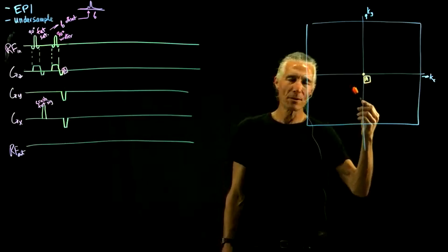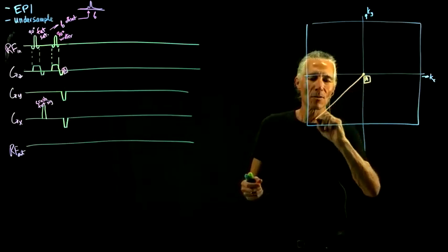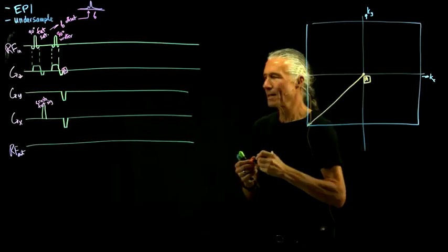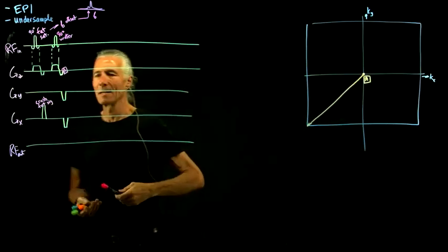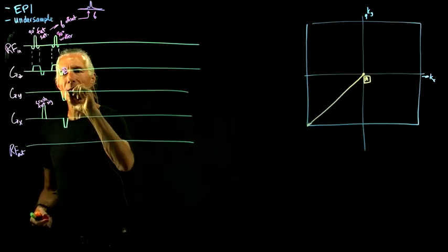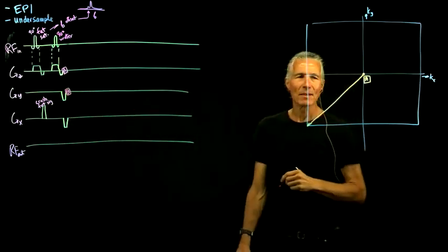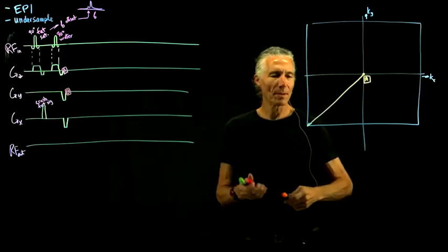If you put those both together, you get sort of diagonal stripes. And so you'll head down to the corner of K space like that. So by the time you get down there, you're at point B. To save time, those are usually done at the same time, but you can conceptually think of them as different. And so then we end up at point B.